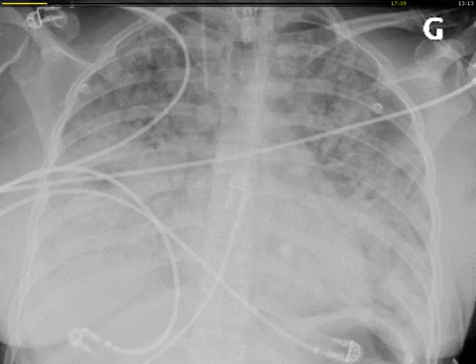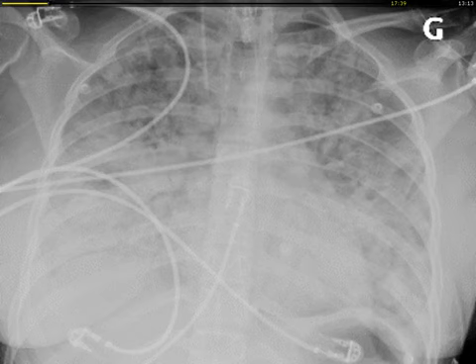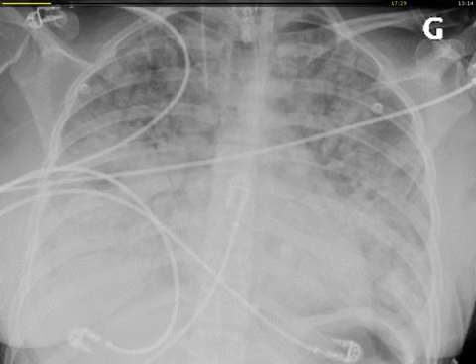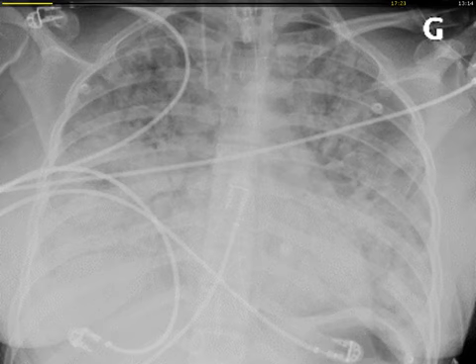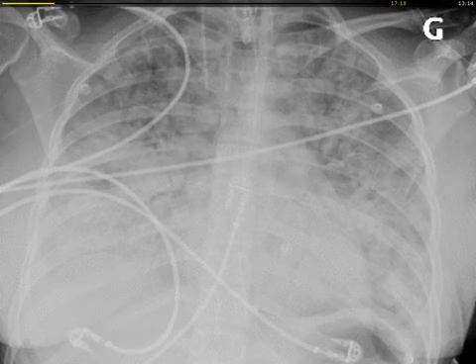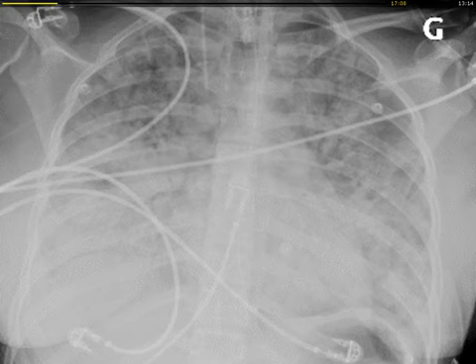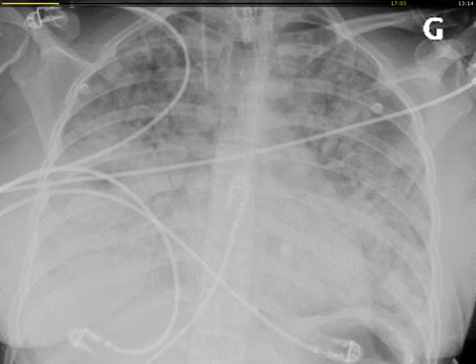to activate IntelliVent. So to activate IntelliVent, is it possible to reduce the size of this screen because we don't see the upper part? So on the top of the screen of the ventilator, we have to activate the 3 main controllers: minute volume controller, PEEP controller, and FiO2 controller. Then we have to select a patient condition. By selecting a patient condition, the ventilator will propose different default target ranges for FiO2, end-tidal CO2, and SpO2.